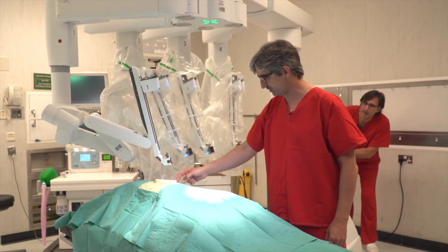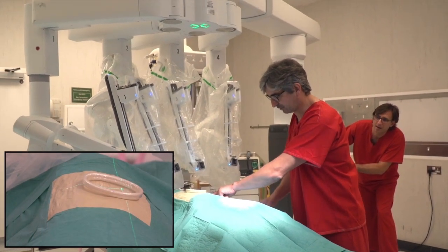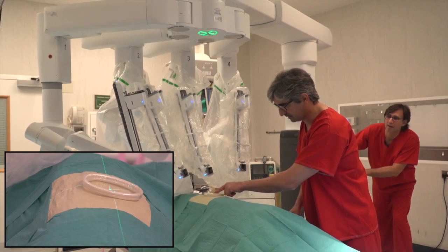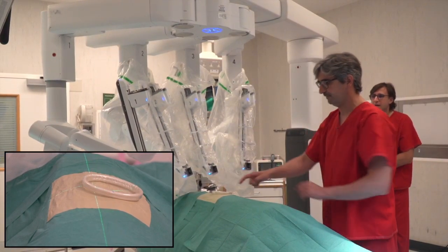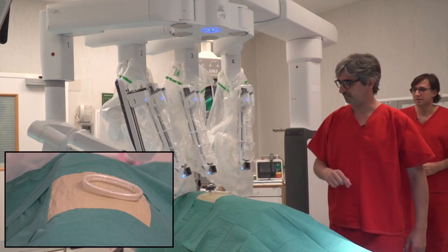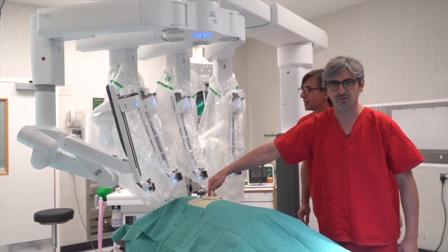Just the cross should be in the upper part, here. You see the cross here? The laser. Go deeper — more. Okay. You can see here — perfectly place the cross on the posterior part of the incision. Very important.